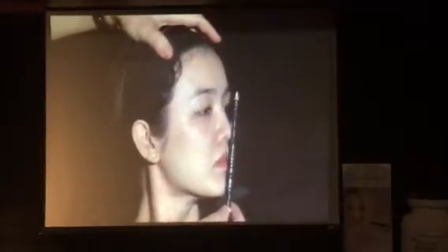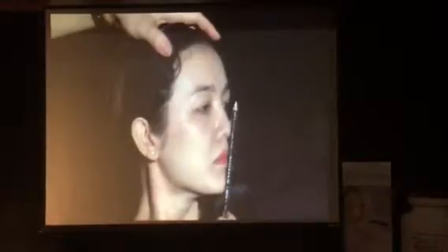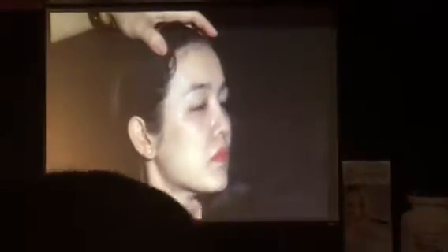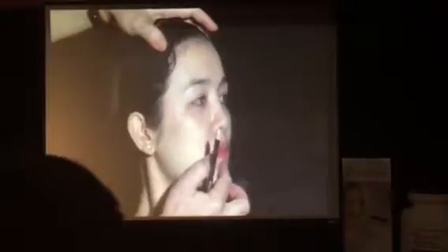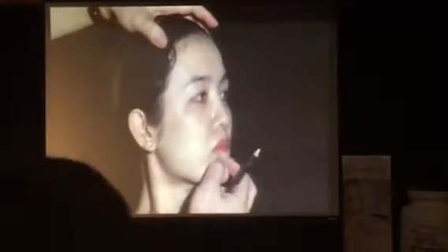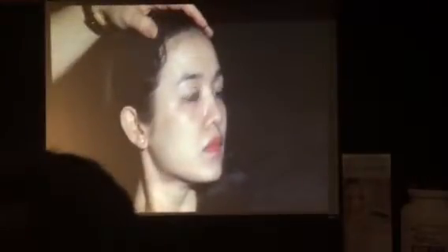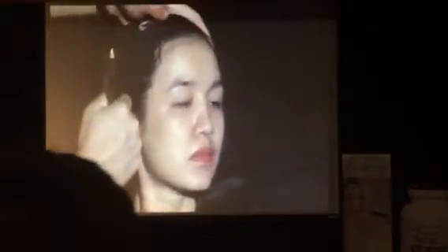If we draw a line from the nose to the chin and it almost contacts the lips, so the lip projection is okay. But I think this sulcus is a little bit too deep. We can lift this sulcus, so this is the C1 we mentioned before.